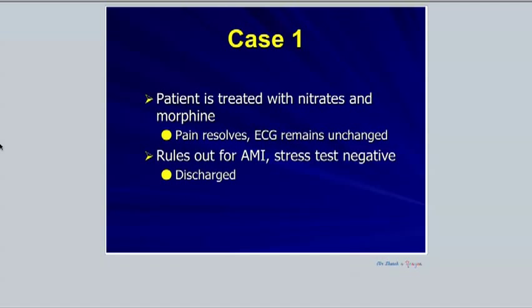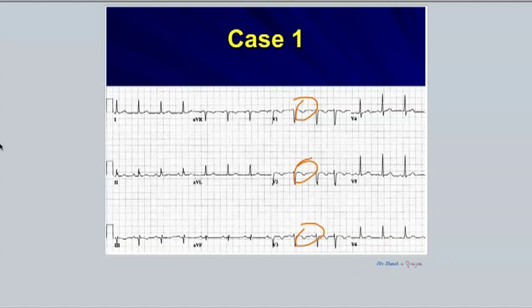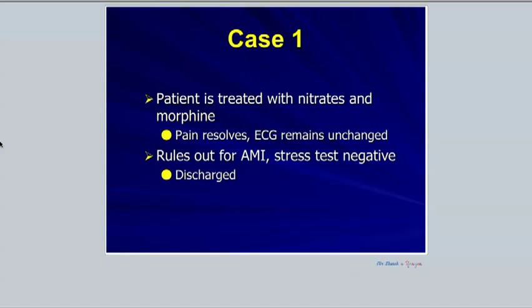So at that point, since he had been ruled out for acute coronary syndrome, everyone washed their hands of the patient. Going back to the very beginning, I said that based on chest pain and shortness of breath post-op, everybody would be thinking that he's got a PE. But in this particular case, because the patient had an abnormal 12-lead EKG, everybody jumped right to the diagnosis of rule out MI, rule out acute coronary syndrome. And once they did that, they forgot to take the workup any further.